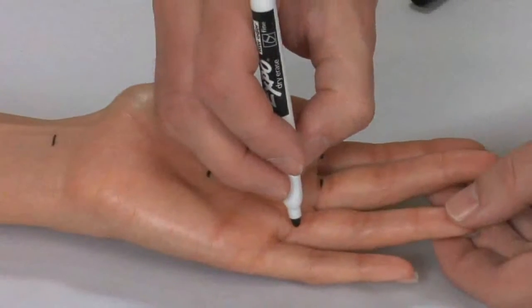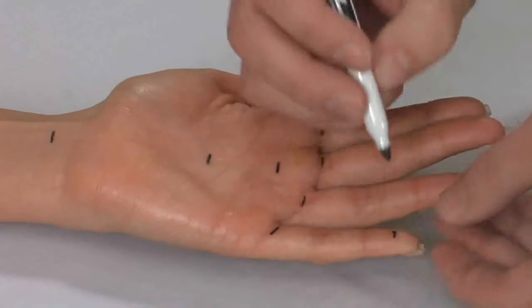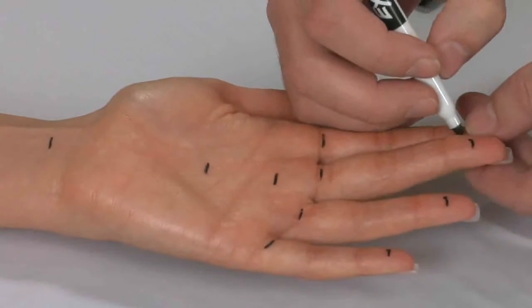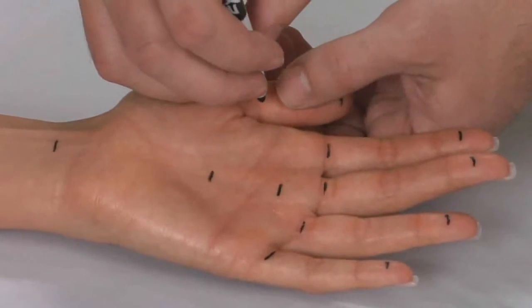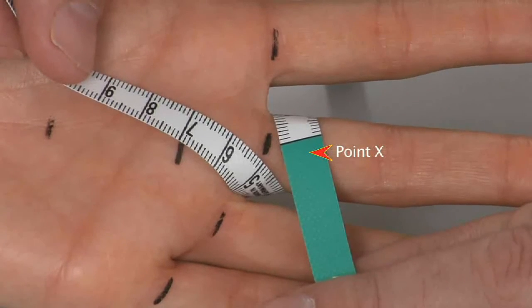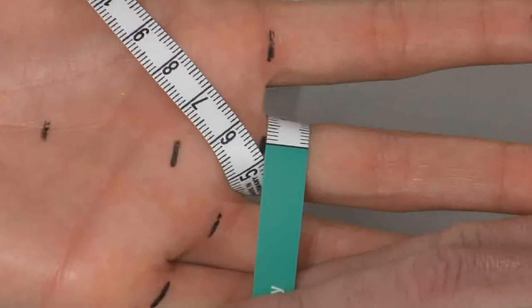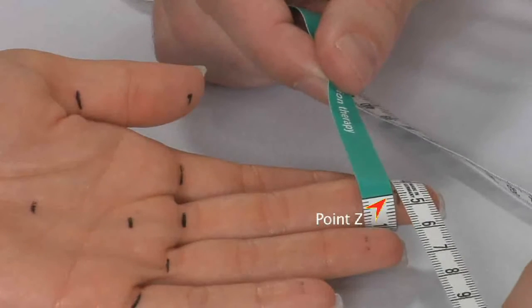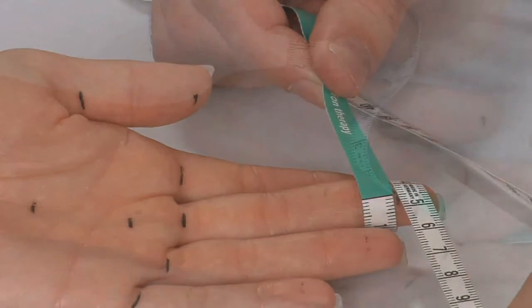The finger circumference points are taken at the base of each finger, at point X, and where the end of the finger stub is desired, at point Z. Pre-mark the X and Z points. The X points are found at the base of the finger, and Z points where you want the glove to end for open finger glove. For point X, make sure both sides of the tape measure touch the mark. You may need to angle the tape measure a little to get the measurement. For point Z, never place the point on the crease of the finger. If the glove finger ends at the crease, the patient may experience discomfort when wearing the glove.